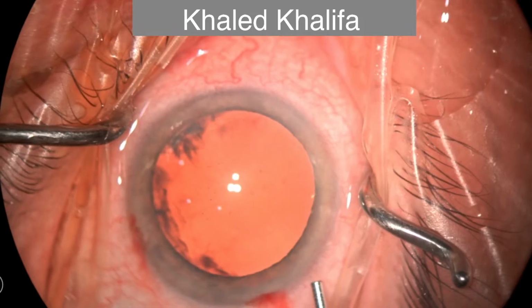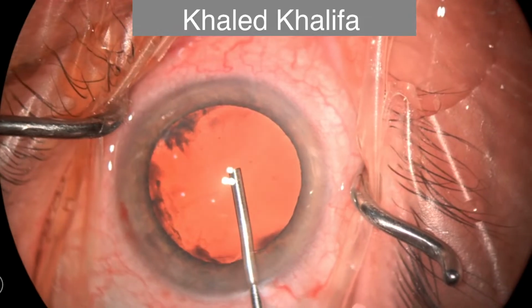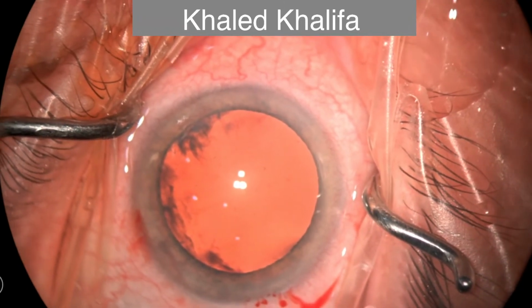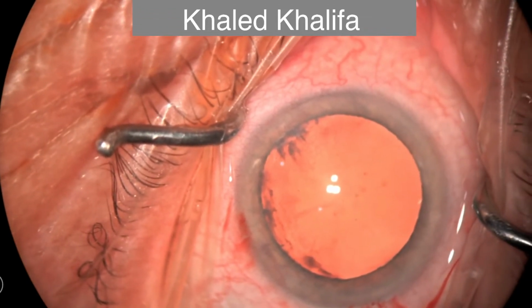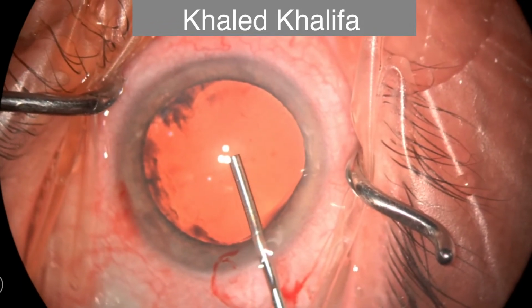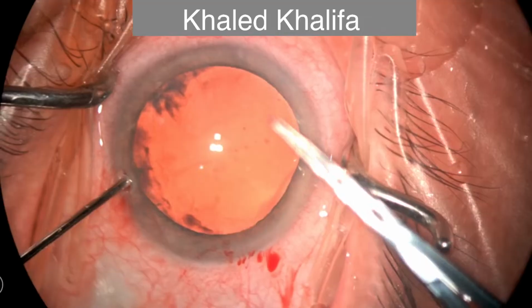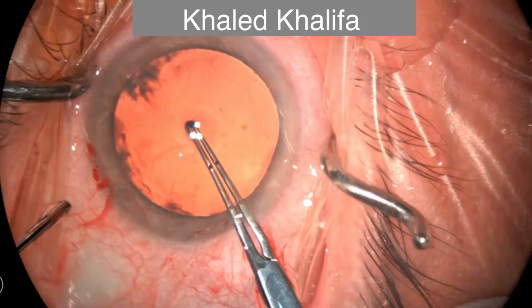Now I'm injecting the OVDs, the dispersive OVD, into the anterior chamber. And as the anterior chamber is shallow, I'm going to inject some sodium hyaluronate with the dispersive OVD, just to keep the anterior chamber formed properly and to deepen the anterior chamber a little bit, as this anterior chamber is sub 2 millimeter depth.